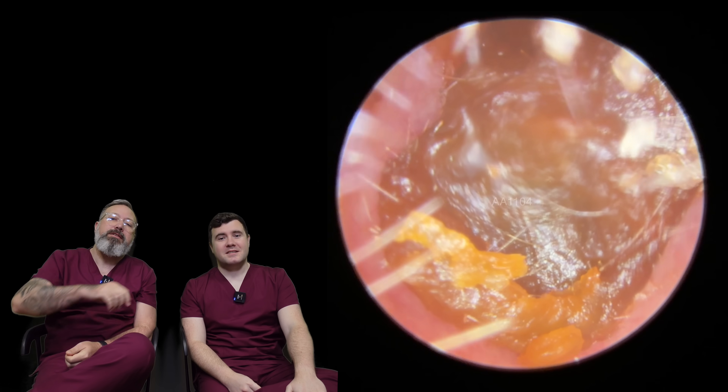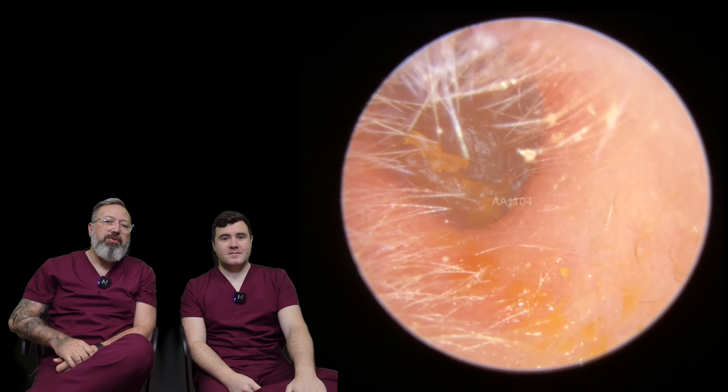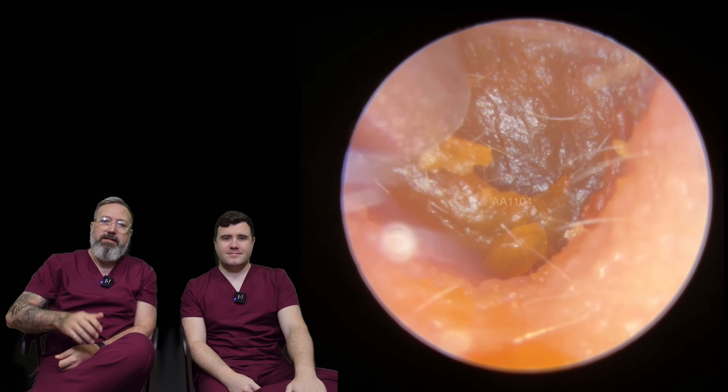So coming up in this episode, guys, we have a pediatric patient with a deep, stubborn wax plug.